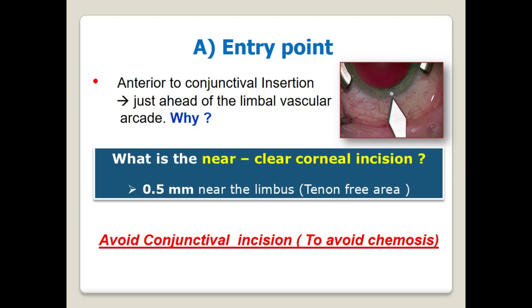Where should the entry point be? The entry point should be just anterior to the conjunctival insertion, in front of the limbal vascular arcade. Keep it as peripheral as possible. Being near the vascularized limbus, the wound heals rapidly.